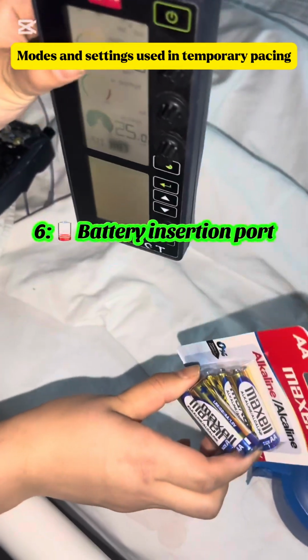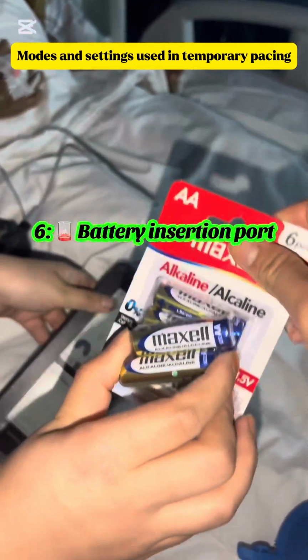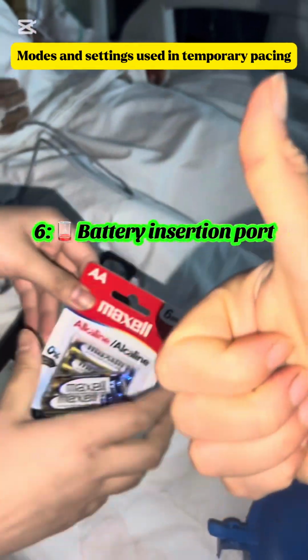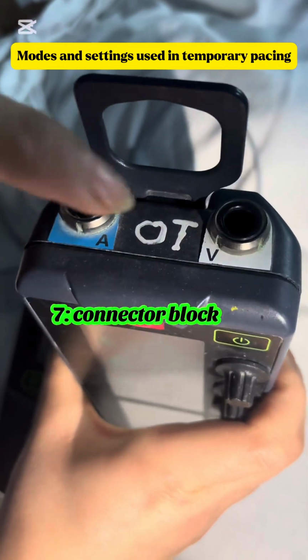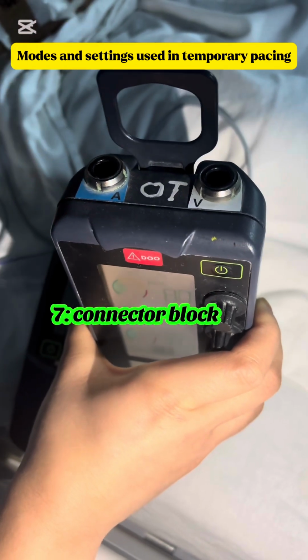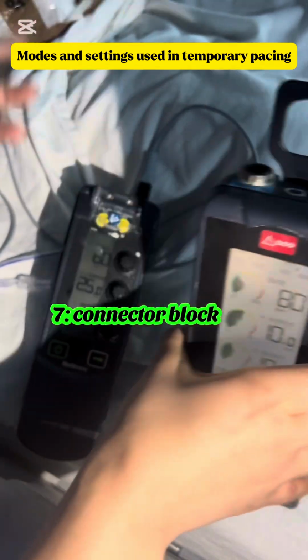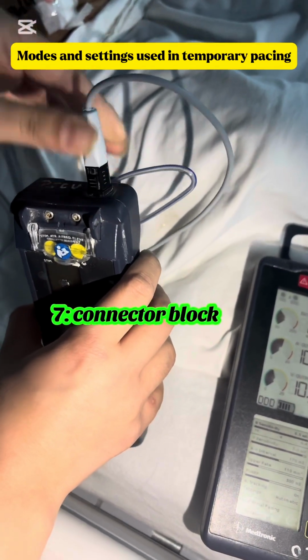And we should always keep a fresh new battery for backup, so that we can change the battery immediately after the battery is down. And lastly, on the top of the pacing box, the connector block has a socket designed for each chamber, A for atrium and V for ventricle, and they are color coded: blue for atrium and white for ventricle.